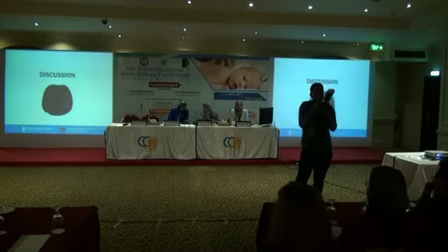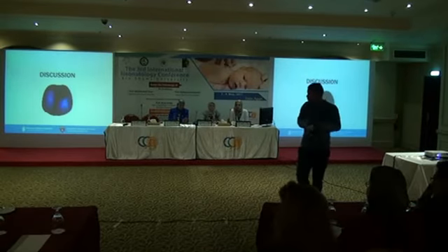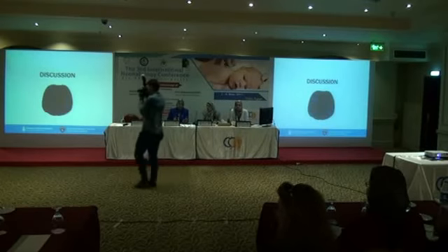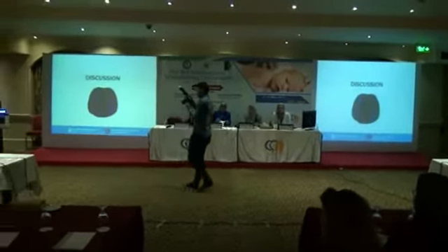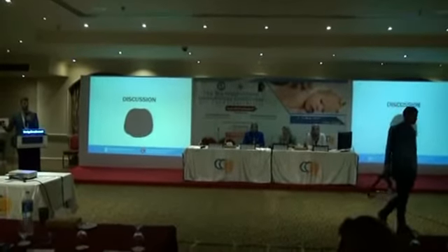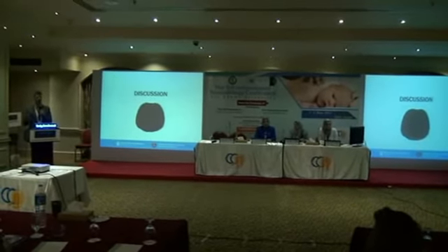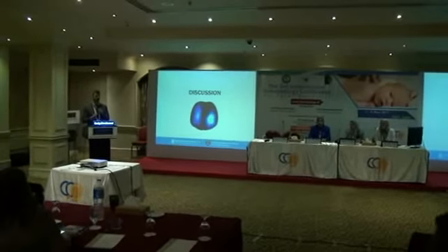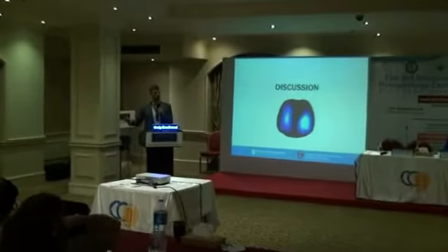Yeah, that's an excellent question. I think exactly what you just used as an example, prone positioning, is exactly where we would want to use it. Right now, we're doing studies to answer these questions. We're looking at ARDS, we're also doing it observationally, and very soon we're going to be looking at prone positioning. But unfortunately, because it's not an FDA-approved device as of yet, we legally can't use it to make clinical decisions outside of a research context.